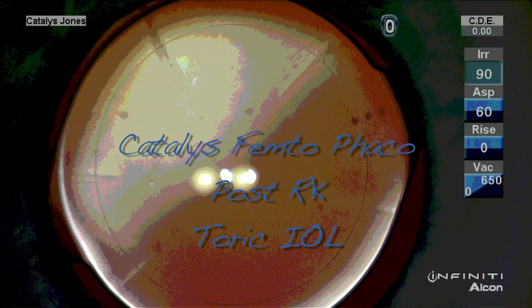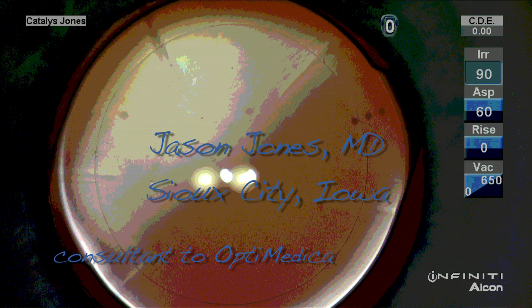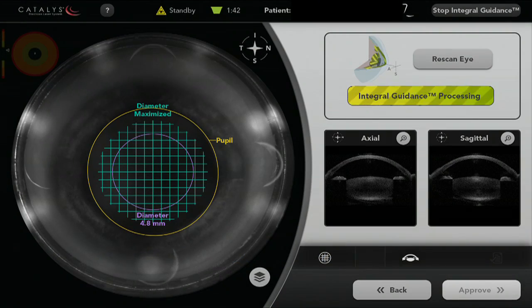For this patient who is 20 years post radial keratotomy, we're going to use a variety of technologies to achieve an excellent stable outcome for her refractive cataract surgery.